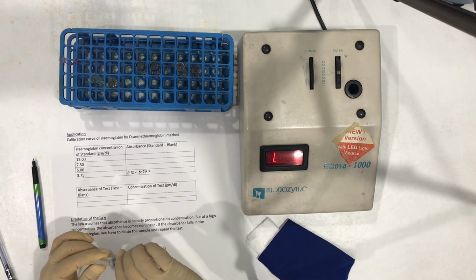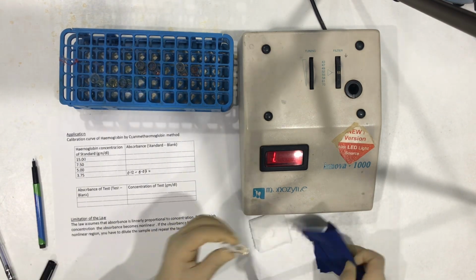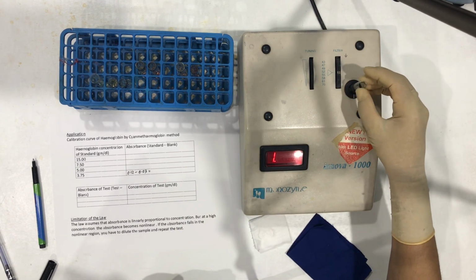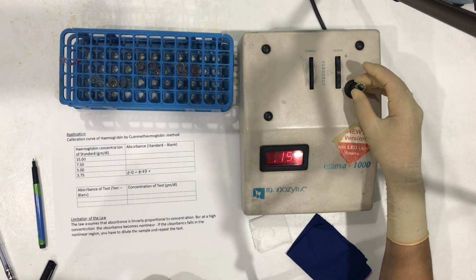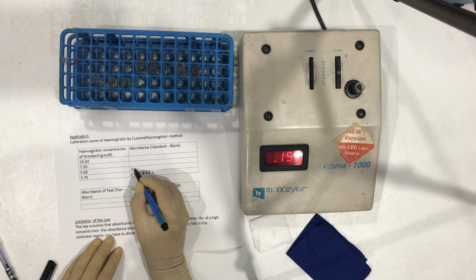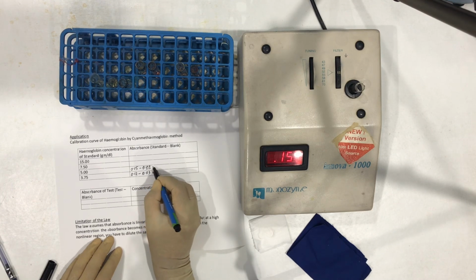Standard 5.0 is giving the absorbance of 0.15. 0.15 minus 0.03.